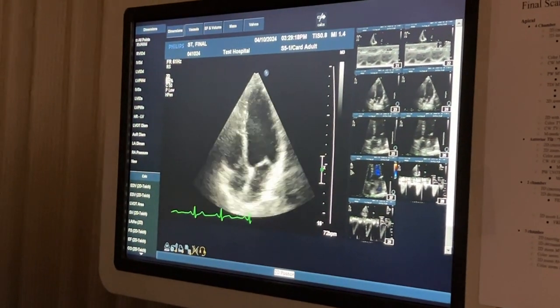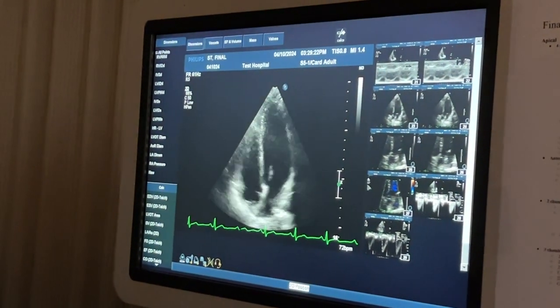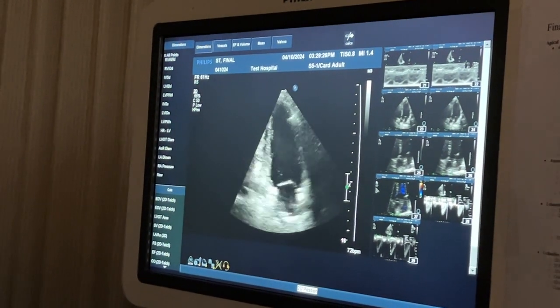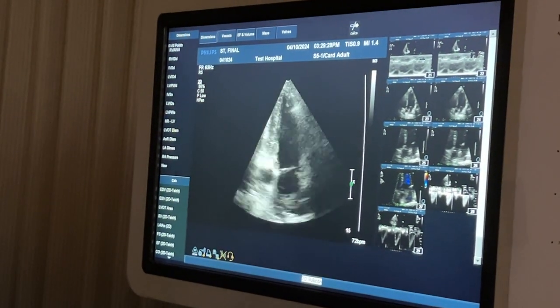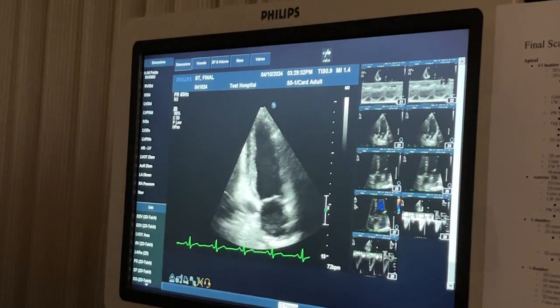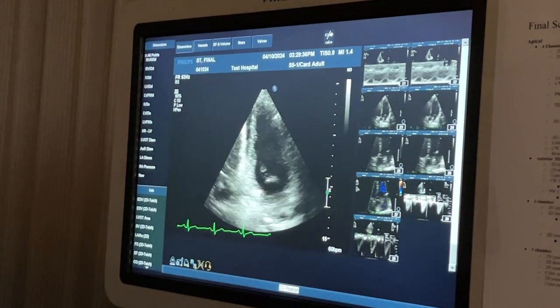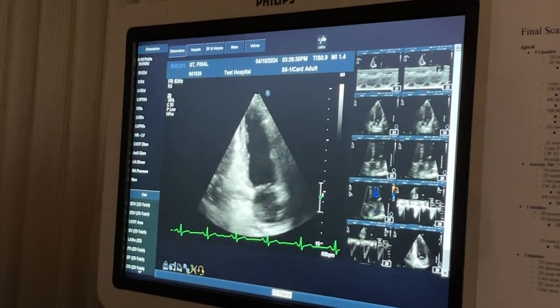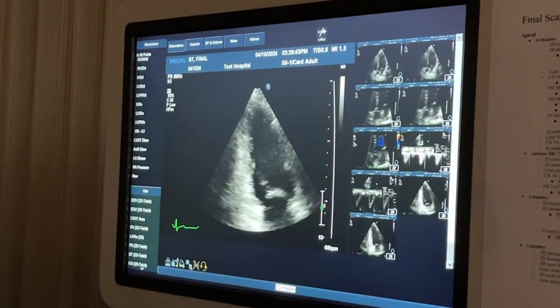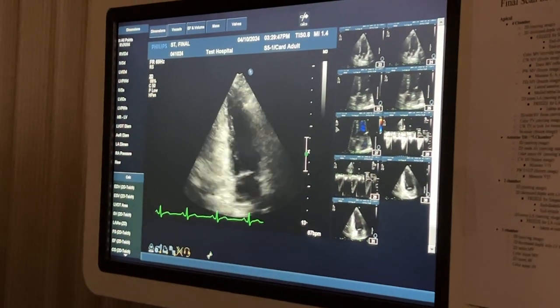Now I'm gonna start twisting my indicator and rotating into apical 2 chamber. So I'm gonna do that here. You guys know all the directions for apical 2 chamber. So pretty. Okay, just gonna make sure it's perfect. 1, 2. 1, 2. I like that one better. I'm a big duplicate image person. Always like, I can do it better. 1, 2. Really like that.